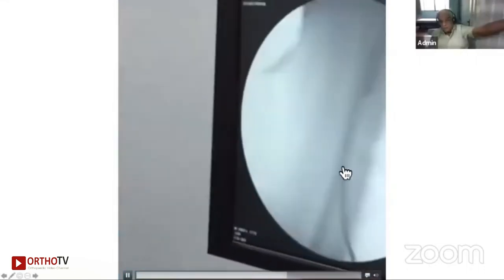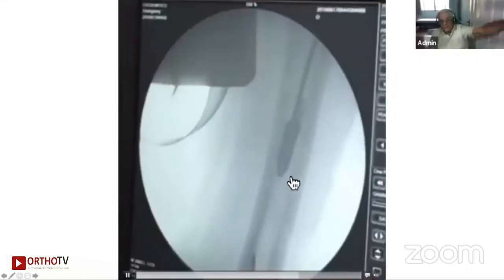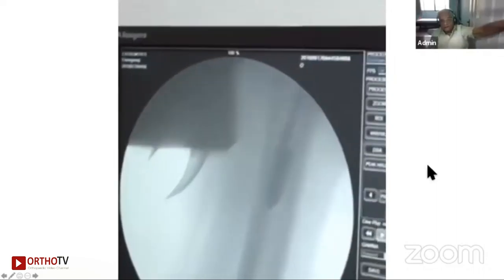And unfortunately it gave way. So I went inside again, holding it so that it doesn't go down further. Now the hooked wire has gone inside. As you can see, it is now inside the nail and then it is coming out. So the whole thing has come out.